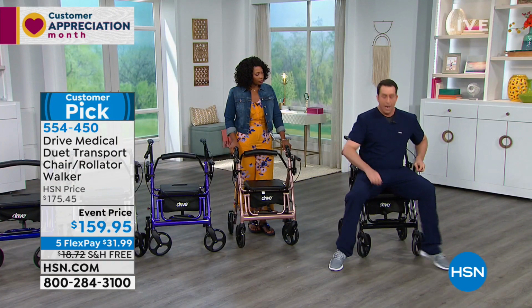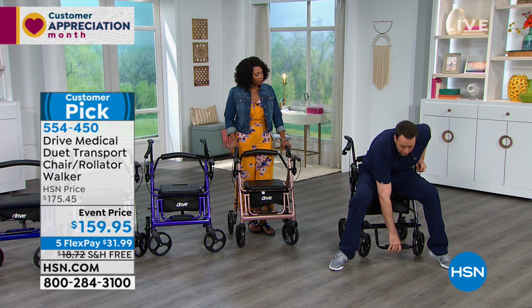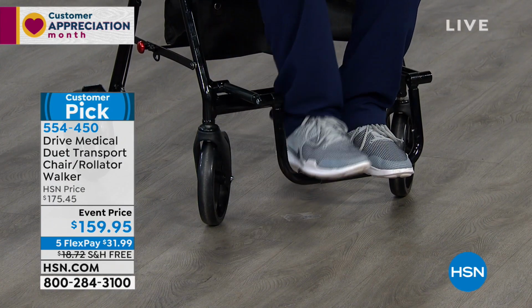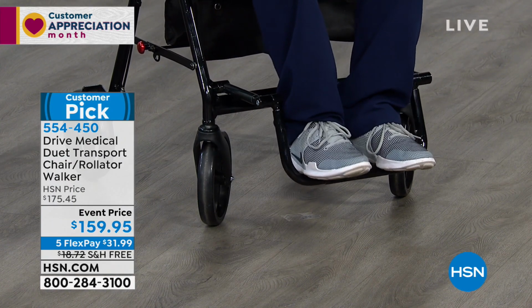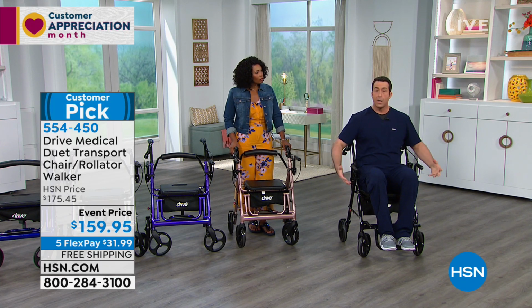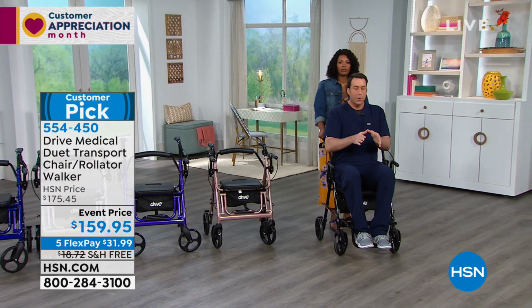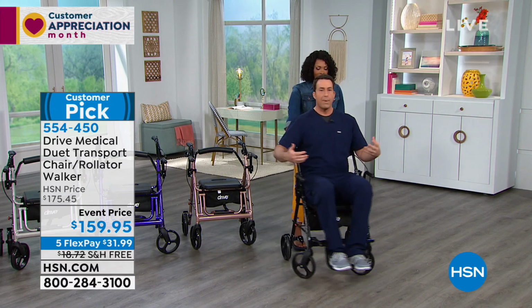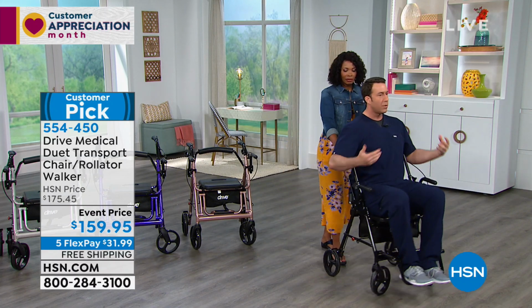Okay. Now, if you've ever pushed somebody in a wheelchair, even if they only weigh 120 pounds or so, wheelchairs are a safety hazard in a lot of ways. They have moving parts that are sharp, that you can get your hands or your feet caught in. They're also sometimes a burden for others to push folks around because they're so heavy. So Tamara, I'm gonna ask you to do the honors. So I weigh 230 pounds, and I want you to push me a little bit and turn to the right or left and just speak to how that compares to when you've pushed somebody in a wheelchair in the past.